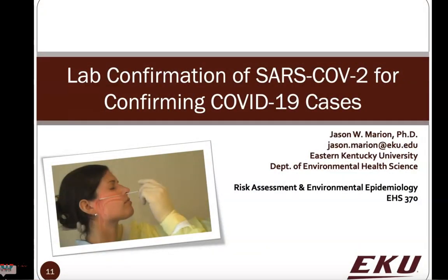So we're all in this together, and in this set of slides here, I'm going to show you this image again that may be something that's hard to look at, but a reality for folks who are going to be going through the SARS coronavirus testing. So let's take a look at this image. What do you see there? That is a nasopharyngeal swab.